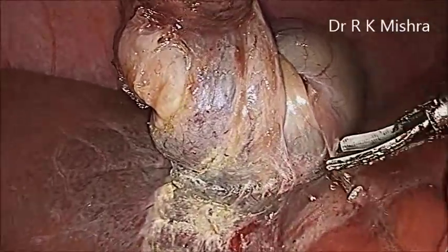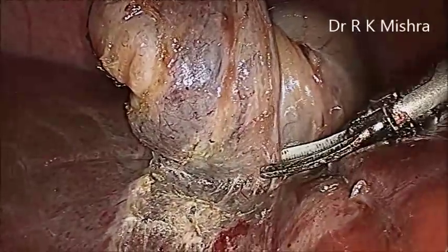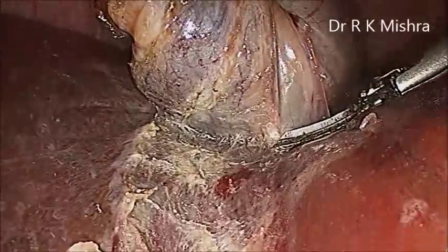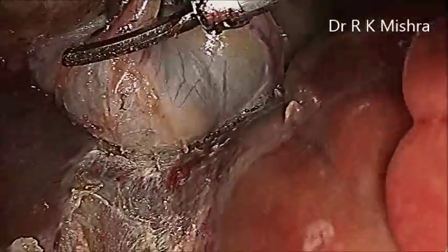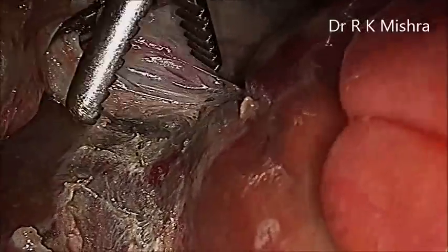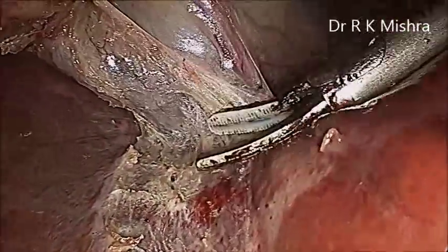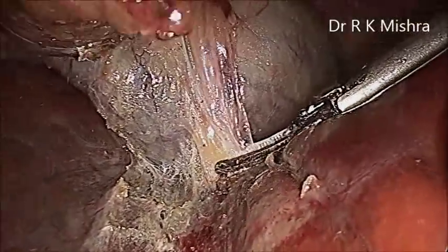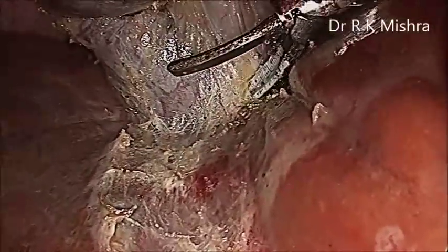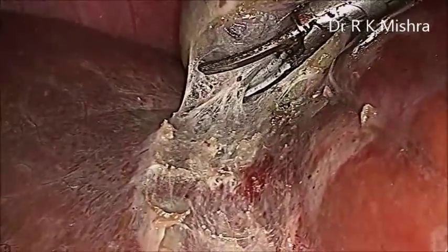Laparoscopic cholecystectomy is the gold standard nowadays, and in experienced hands, the complication rate has recently been dramatically reduced. Previously CBD injury was approximately 0.5%, whereas it is 0.1% in open surgery. But in the recent data which we have published, after the better training facilities now available, the complication rate of laparoscopic cholecystectomy has reached the same as open surgery, that is approximately 0.1%.